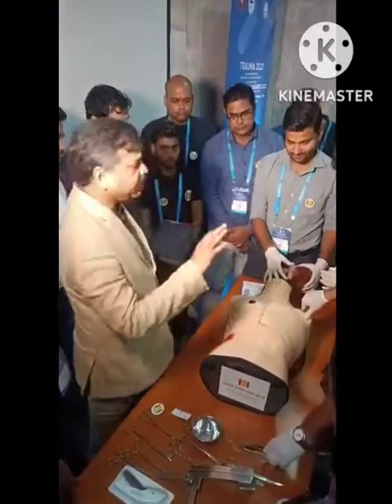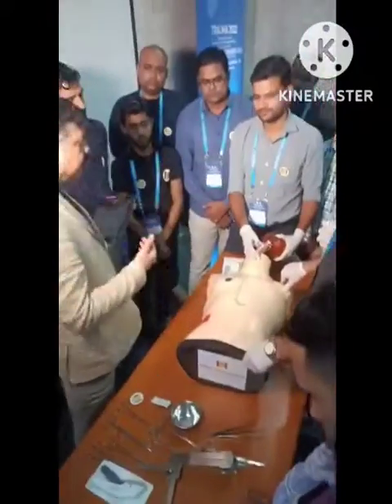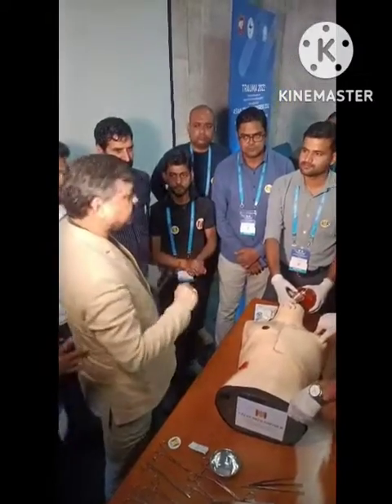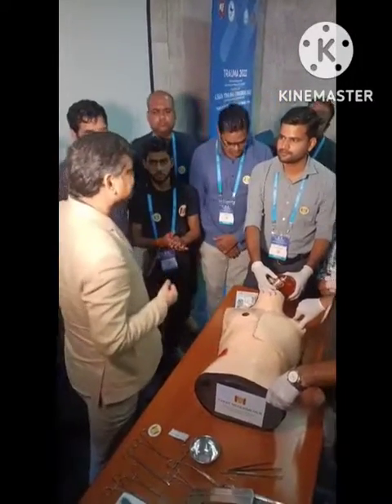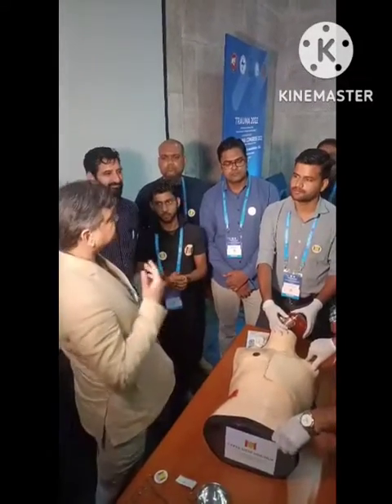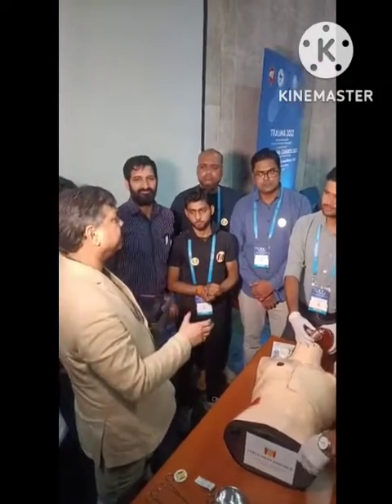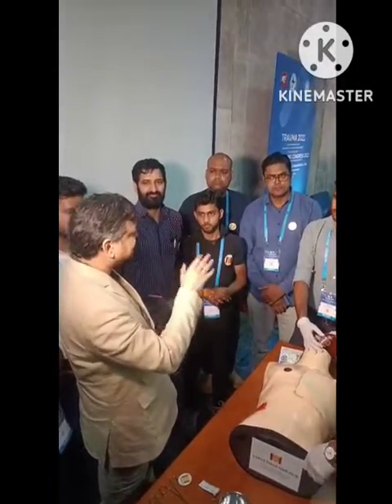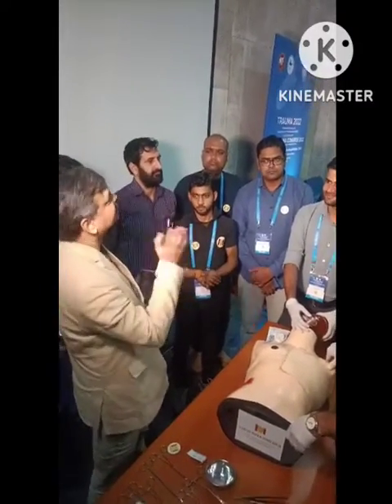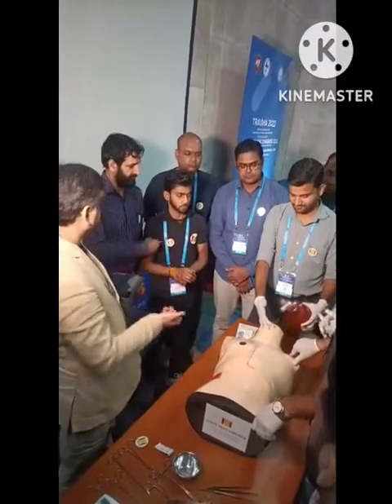यहाँ एक तो I said ना, psychological safety को हमें simulate करके देखना है. अगर हम नहीं करेंगे ना, we will never learn. If we assume things, हाँ मैं कर लूँगा, because I used to do those things, पर जब हम रियल में करते हैं, and there is a concept, deliberate practice. We must do deliberate practice. अगर छोटा BVM भी करना, I'm telling you, most important skill in airway is BVM only. जब रियल में CPR होता है तो BVM का seal नहीं बन पाती है. ओके, तो मास्क भी दे दो.